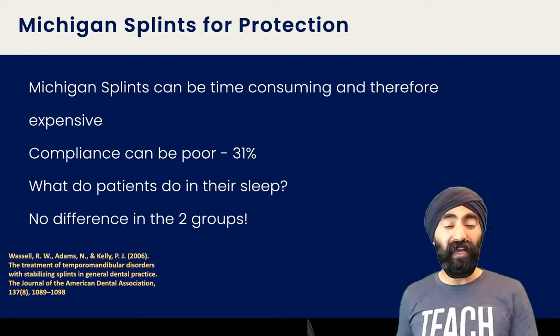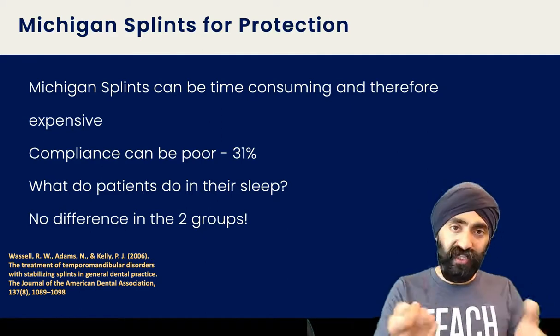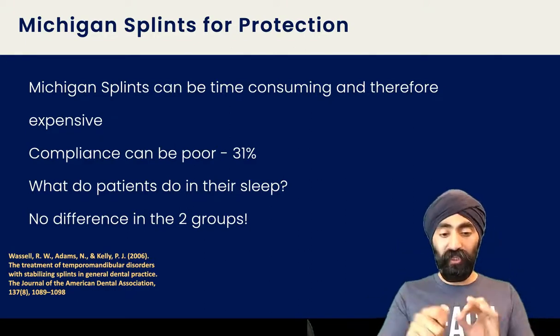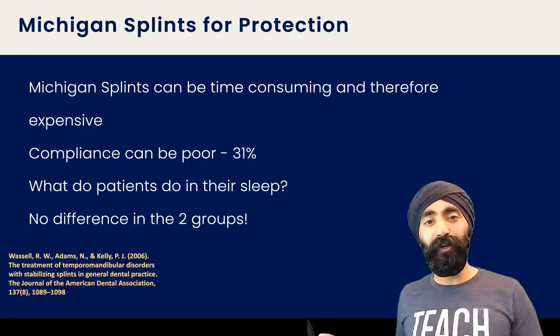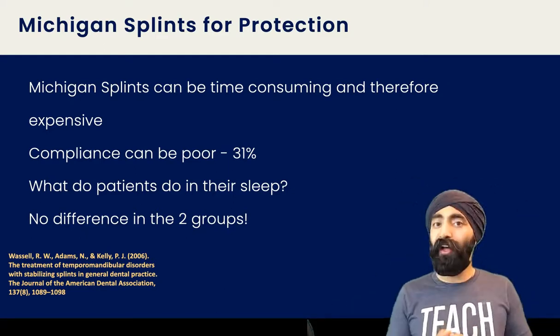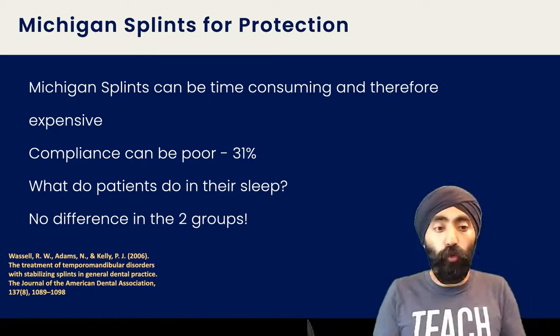were actually wearing this. And the funny thing is, we spend all this time adjusting this splint while the patient is laying down. Okay, so the patient's laying down, we're adjusting it, and we get them to bite, grind left, grind right, while they're completely straight lying down. But when they sleep in funny positions, right? We all know as we move our head, our occlusion changes. So how does that factor into it? I don't know, but it's just a thought for you, okay?